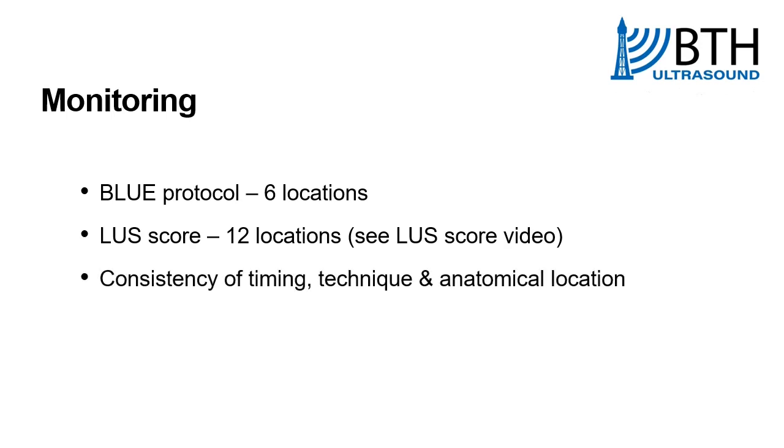With whatever technique for monitoring you use, there's a certain degree of consistency. So perhaps timing, a particular time of day, or on regular occasions, certain timescales would be useful, as would the technique, with what machine settings and probe you use, and the anatomical location on the patient themselves. So just to keep that consistency so that you're getting to understand that there is a change, and that it is actually potentially a relevant change.